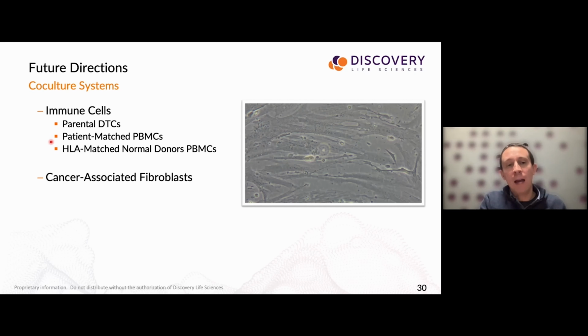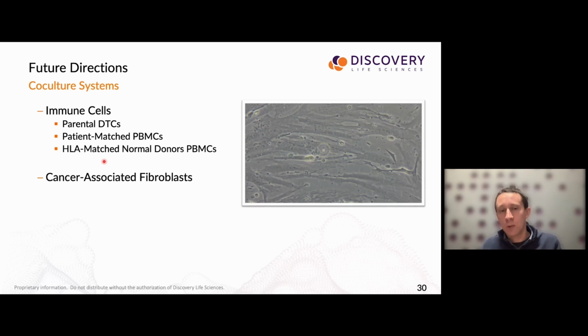In the absence of that, every time we do make a tumor collection, we try, and largely succeed, in also collecting whole blood from the same patient. So those also provide a nice component of the immune system test. And then finally is a more unique system. So in the process of doing the whole exome sequencing, we do have 6-digit HLA resolution across both the class 1 and class 2 loci.